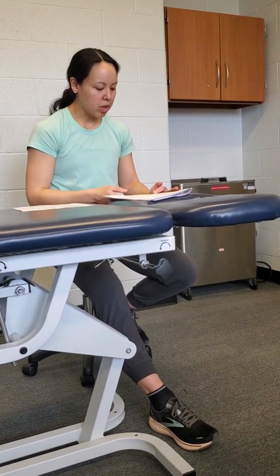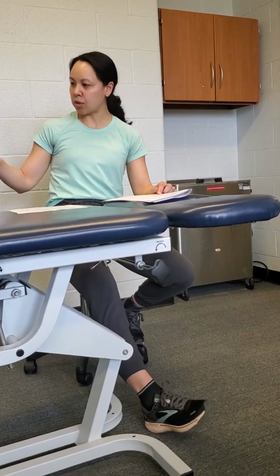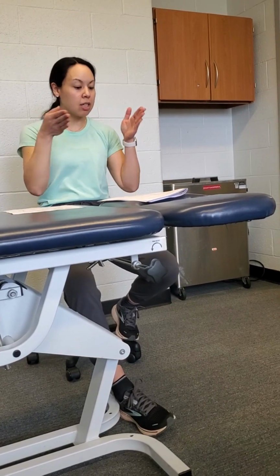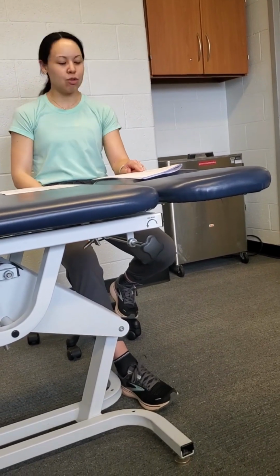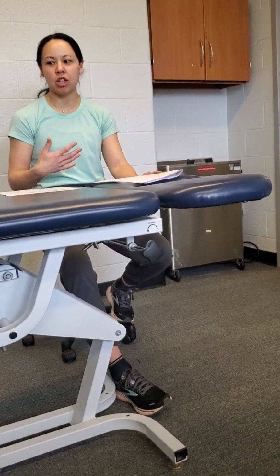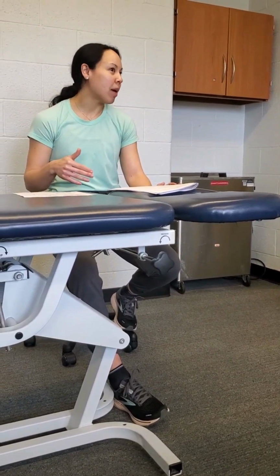And then once you get the cuff on, you hit the blue PTP button, and then it's either gonna accept or reject. So accept means you've got an accurate number, you can start exercising right away. Reject usually means there's an error with the reading, and it could be that the patient was talking, or the patient was moving even a little bit.